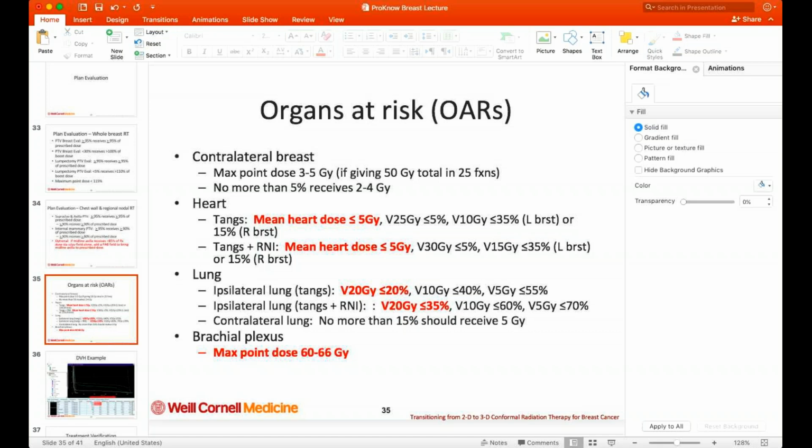Is there any difference in terms of side effects while comparing the two fractionation regimens in the study? So I assume that you're talking about the 42.56 gray hypofractionation versus 50 gray. I think that was Dr. Lulabuka. Oh no, that was not Dr. Lulabuka. That was Dr. Adeniji Adeoluwa.